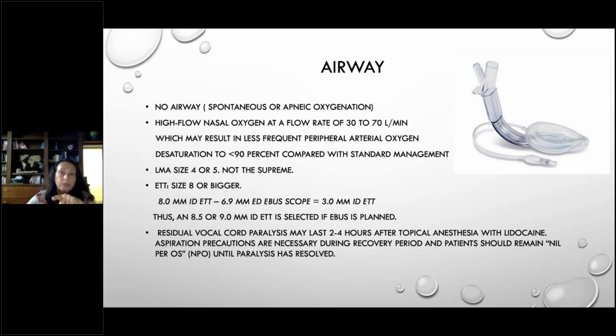The only LMA that cannot be used is the one that I'm showing in this picture. This is a Supreme LMA, because the lumen here is actually elliptical. It's not circular, so it is impossible to pass a large-size bronchoscope through it or put the breathing tube through it. Other LMAs can be used safely, but I prefer LMAs with a hard bite block built in, such as the Aura or, I'm blanking on them right now, the ones that have a hard bite block.